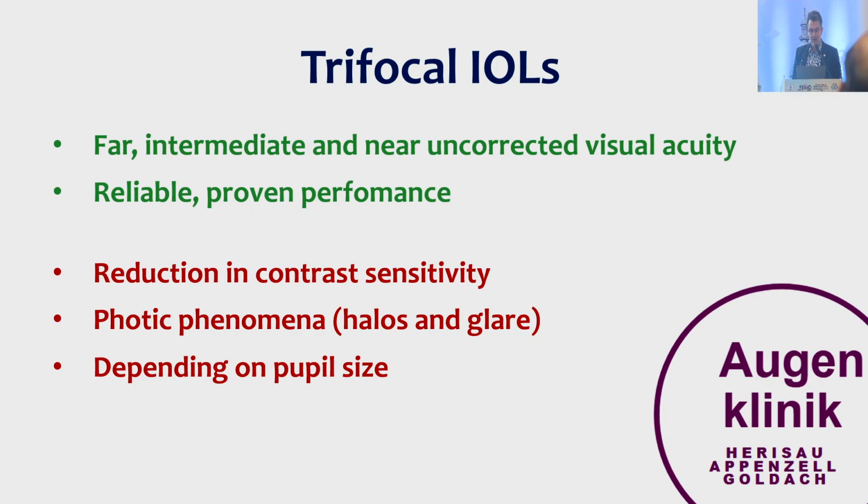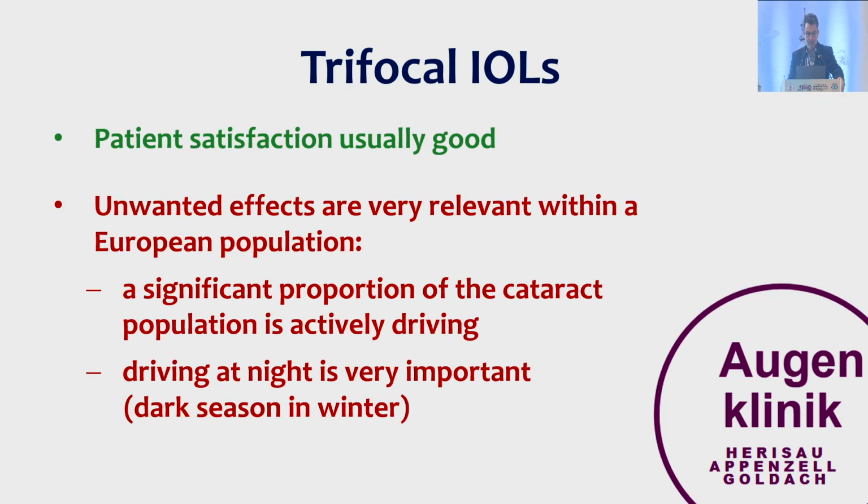So trifocal IOLs that we have been using in the past have excellent far, intermediate, and near uncorrected visual acuity, and they have a reliable, proven performance. However, essentially there comes a reduction in contrast sensitivity, some photic phenomena that we're all aware of, and of course it's depending on the pupil size, which is a problem in the aging population, especially in Europe.